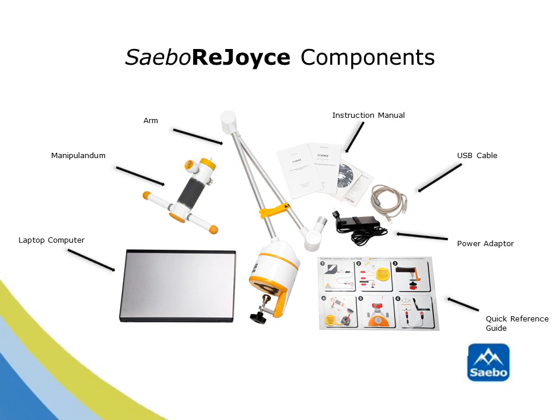Installation for the SABO Rejoice will take approximately five minutes. Included with the device is a laptop computer, the manipulandum, the SABO Rejoice arm, instruction manuals, a USB cable, a power adapter, and a quick reference guide for easy installation.